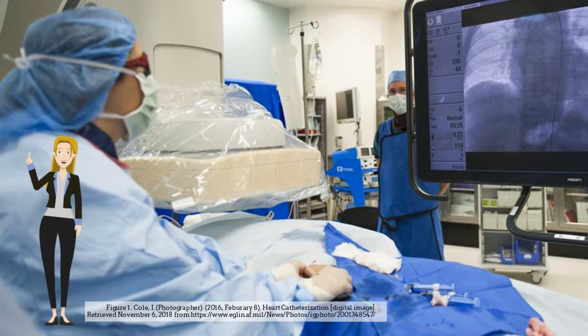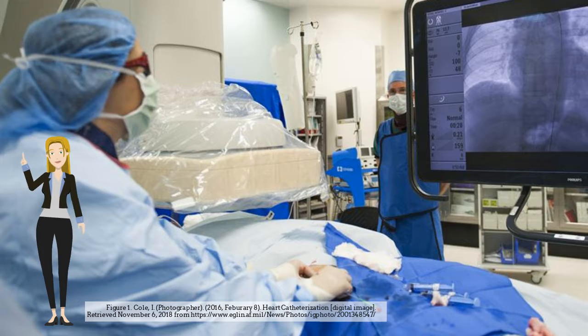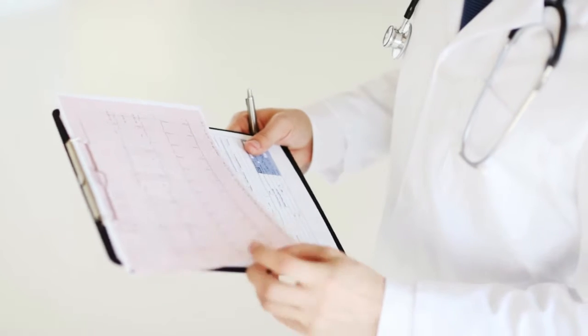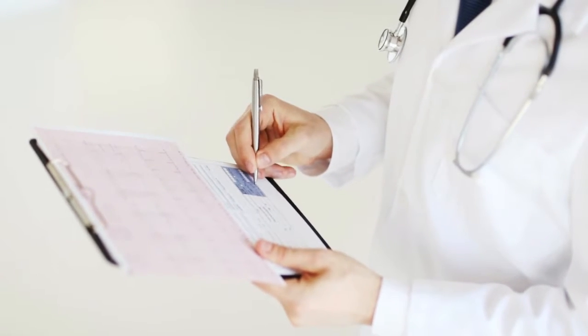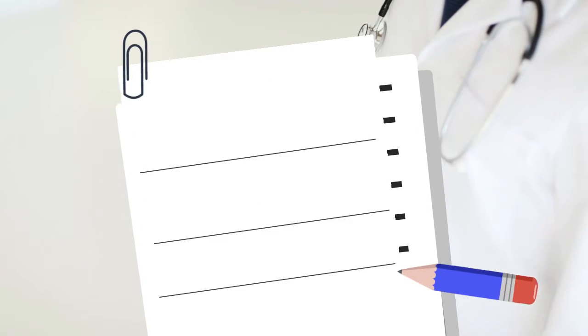Cardiac catheterization is a procedure done to evaluate your heart by inserting a small catheter into a large blood vessel that leads to the heart and using X-ray images to visualize the arteries, heart valves, and chambers. There are 4 major reasons for your doctor to decide it is medically necessary to perform a cardiac catheterization in an attempt to understand how your heart is working, or why you're having chest pain, for example.